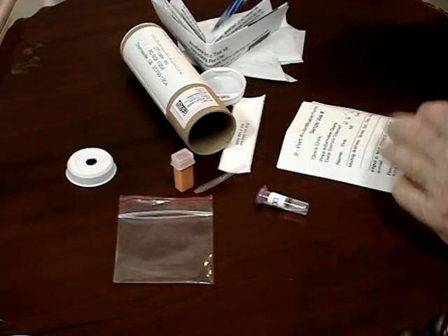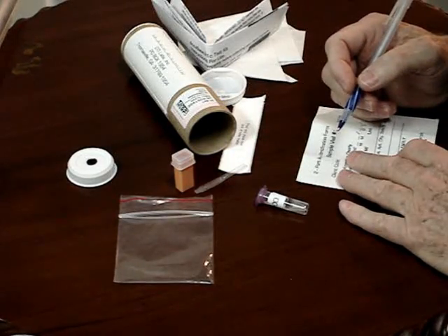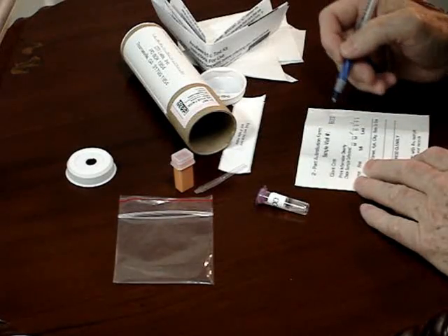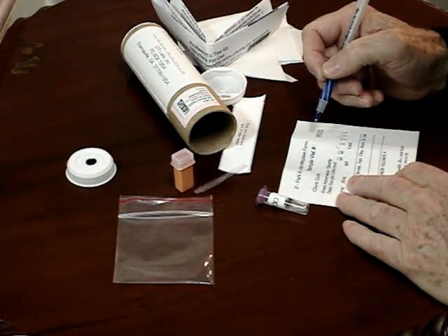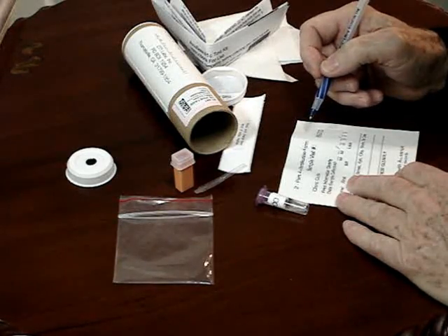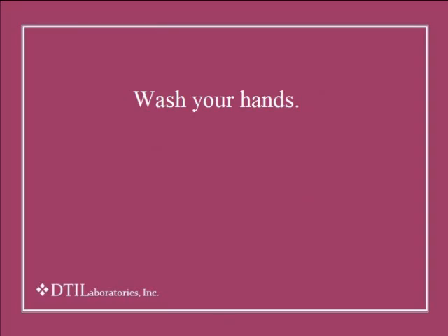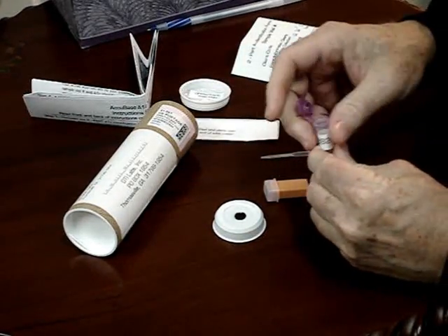First, complete the two-part lab ID form. Note that you are to keep the yellow copy for your records, as it contains the sample ID number that is necessary to track your test results on our secure website. We're going to pause now while you wash and dry your hands. Open and place the reagent vial in the workstation.